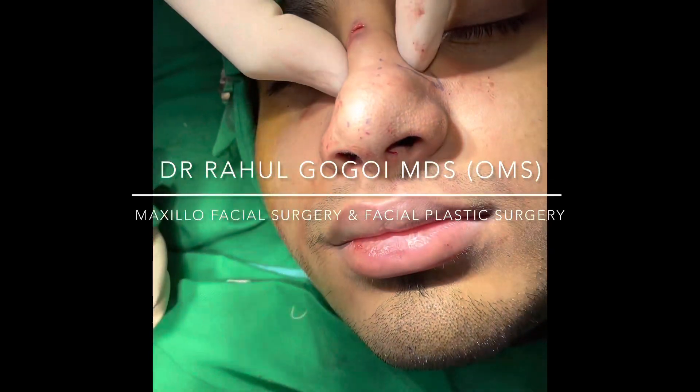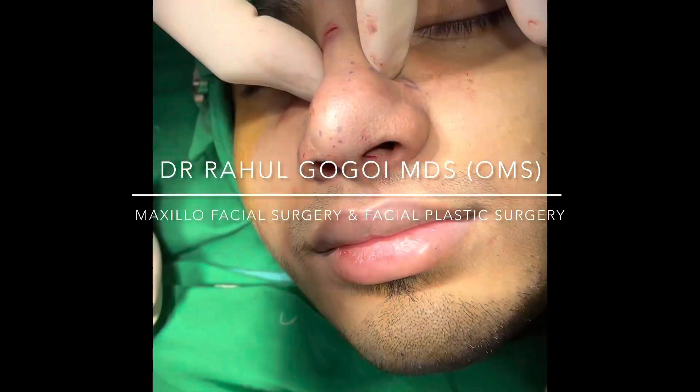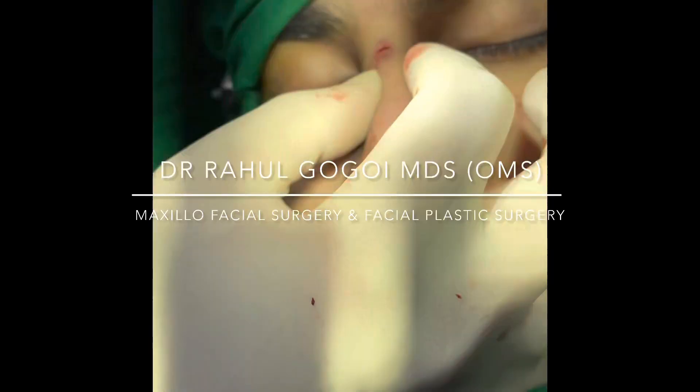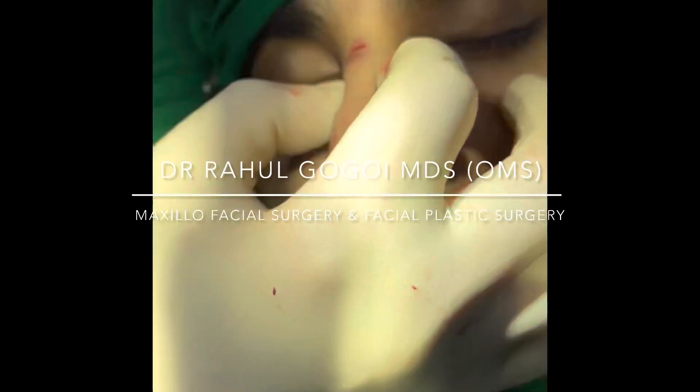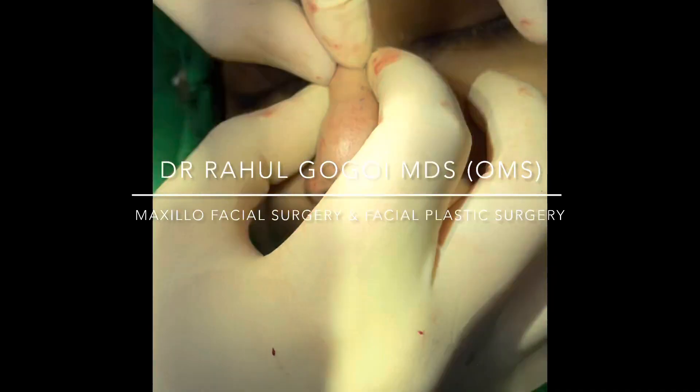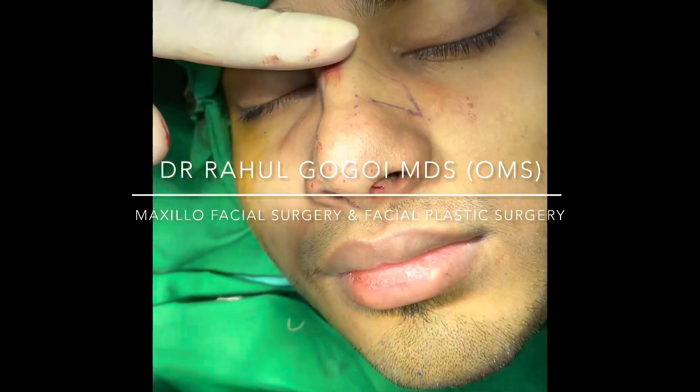As you can see, this part is now mobile. You can see the bone, you can see the nose, how easily it's moving on both sides — so it's completely loose. That's how we push the bone down; we push the nose down and we've eliminated the hump.